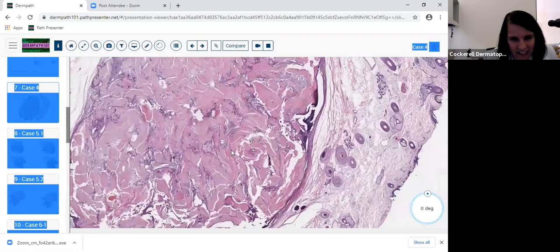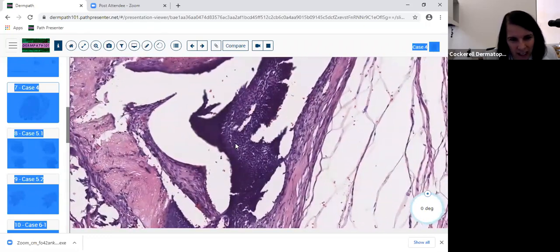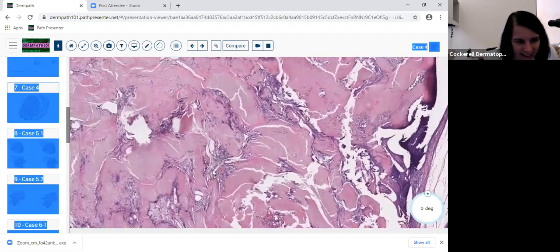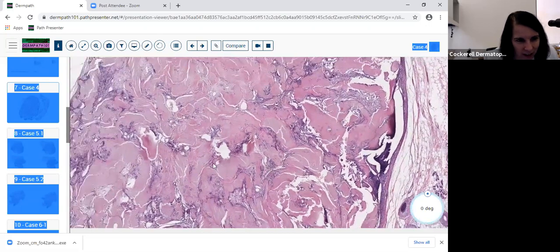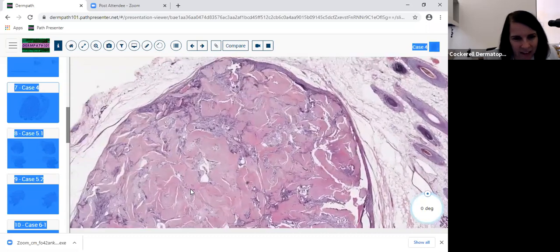So again, I would call it ruptured, and it's not a malignant process, a totally benign process. And this is supposedly hair matrix differentiation here, so it's coming from that area. You can polarize this and it's birefringent. What other things can I tell you? The calcium, you can do a von Kossa stain. There's no calcium in this.